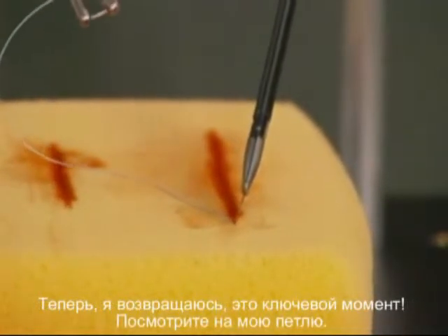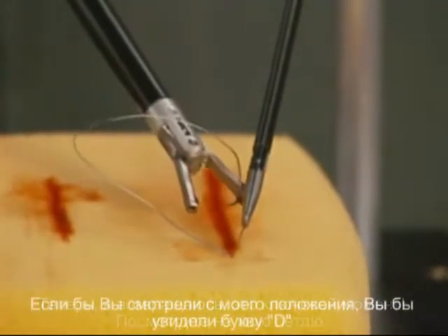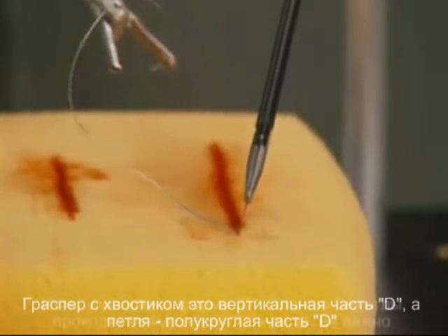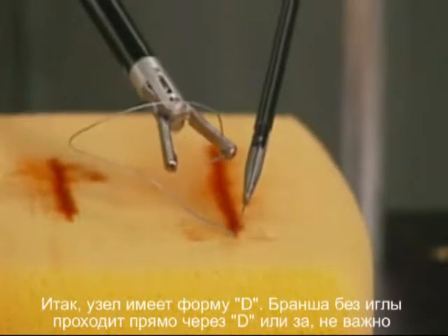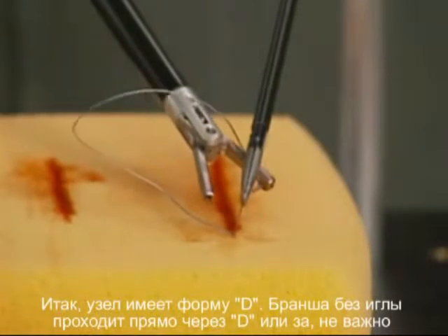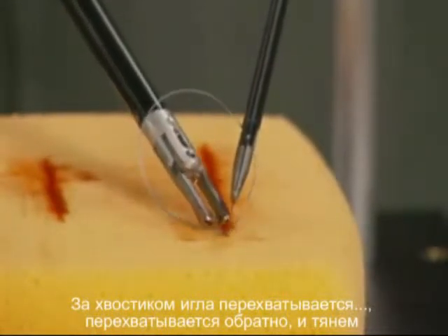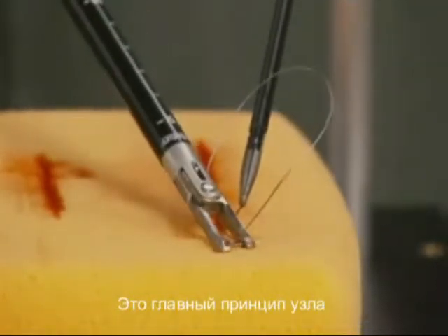One of the key aspects is looking at my loop. If you'll notice, it forms a D with the post being the vertical part of the D and the loop being the round part. The free arm at the end of the stitch without the needle goes right through the D. From your perspective it's a backwards D, but it doesn't matter. Now just go behind the post, transfer the needle, transfer it back, and just pull. That's the fundamentals of the knot.